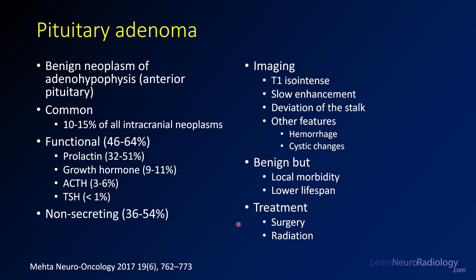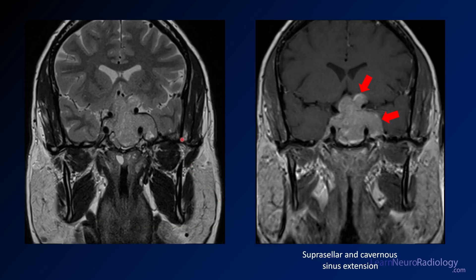Here on the T2 you have a slightly hyper-intense to gray matter lesion centered in the sella, also going into both cavernous sinuses — a little more on the left. The description of these is often like a snowman — you can almost see this outline, with a head and a bigger thicker body. In this case the adenoma is extending to the suprasellar region and extending beyond the cavernous sinus, so both of those structures are involved.